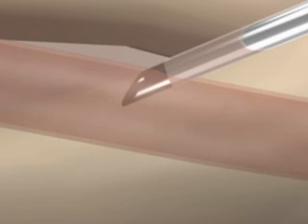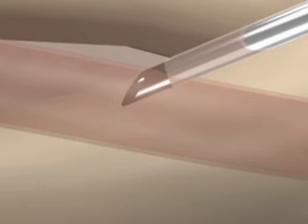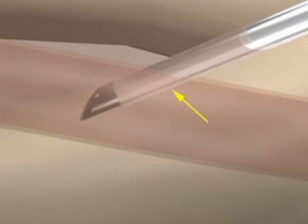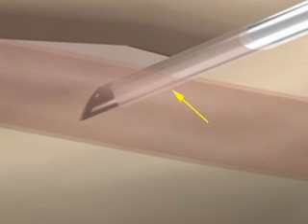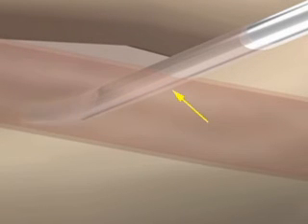By advancing the needle slightly farther after the initial flash of blood, the catheter can enter the artery allowing for successful cannulation.